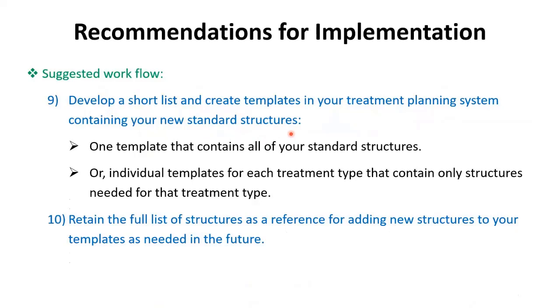So there will be one we call the global structure set that contains all the structures that you are using in your department. You call it, let's say, template one. Okay, and it has all the structures. It has the 100 structures or 150 structures that you are using in your system. Then from these 150 structures, you create the sub templates.